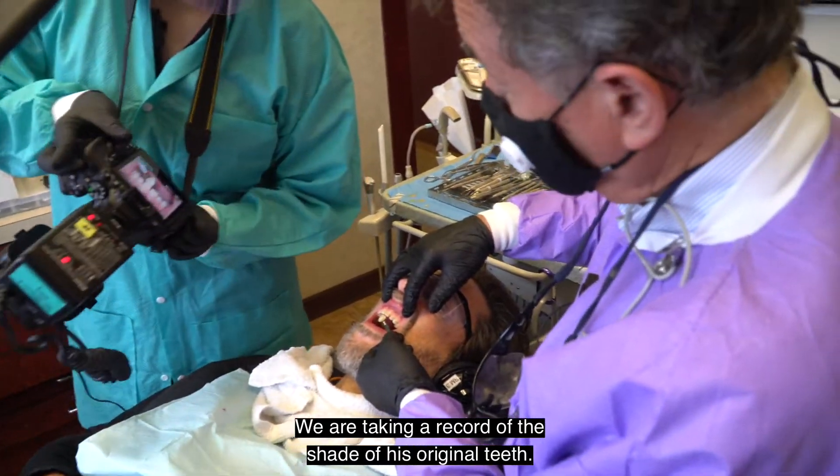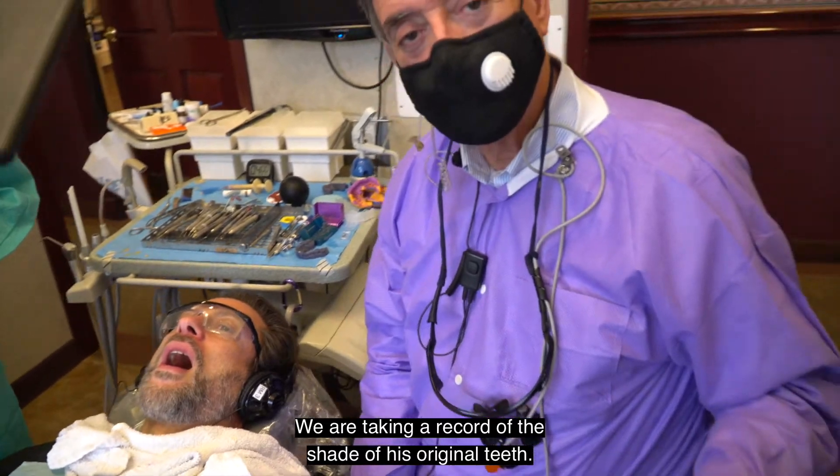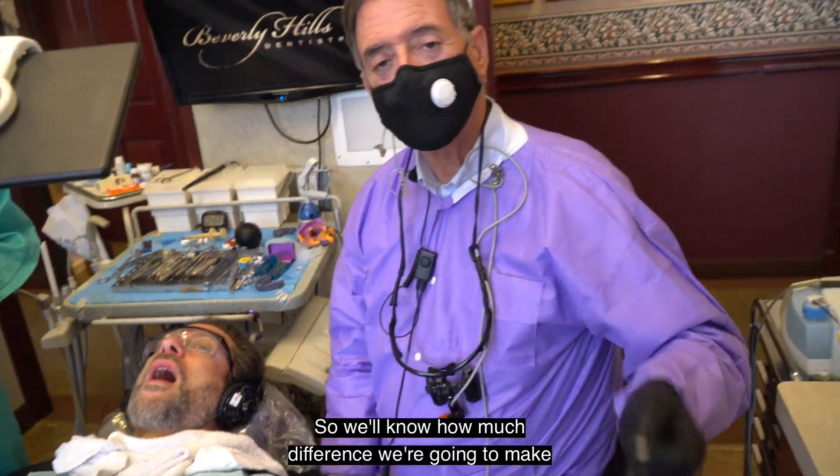We are taking a record of the shade of his original teeth so we'll know how much difference we're going to make.